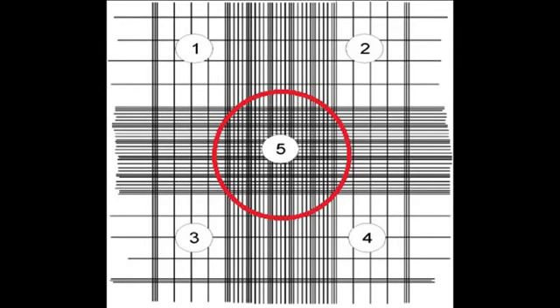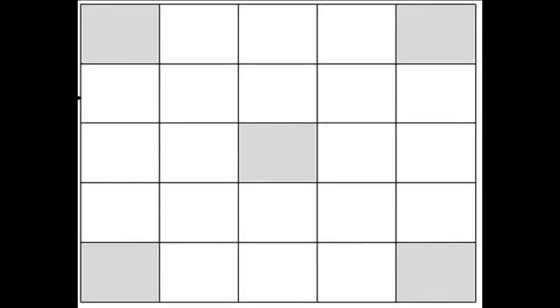Place the hemocytometer into the humidity chamber and let it sit there for two to five minutes. You are now ready to count the red blood cells under the microscope.